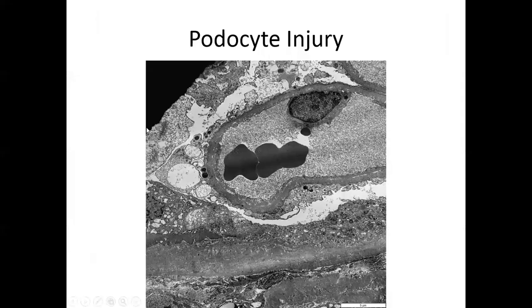Okay, here are just other pretty examples of podocyte injury. Here's a podocyte here that has these large cytoplasmic vacuoles. There's a lot of research now about autophagy in podocytes and how the podocyte should be extremely autophagic. It should completely be always turning over its cellular machinery because, as we think about it, it's pretty much terminally differentiated. It's very hard to get a new podocyte. So they have a very high autophagic flux. Proximal tubular epithelial cells also do a lot of autophagy, and when you start to slow the rate of autophagy, they are more likely to detach in rodent models, and they are more likely to result in segmental sclerosis in rodent models.